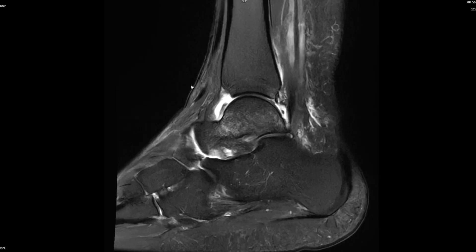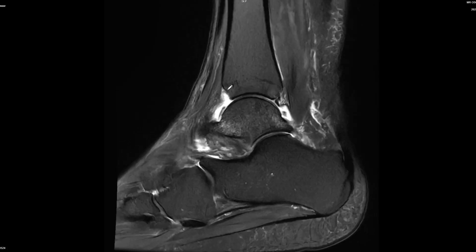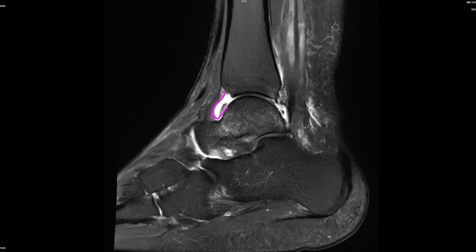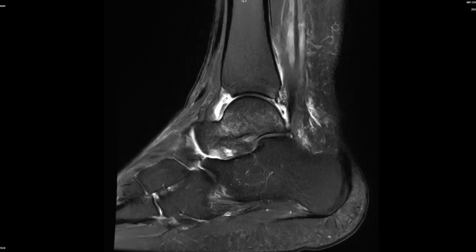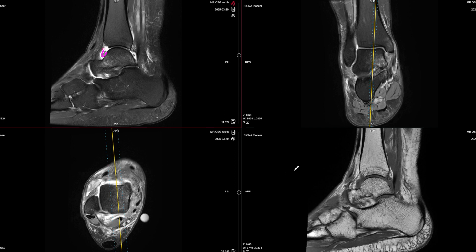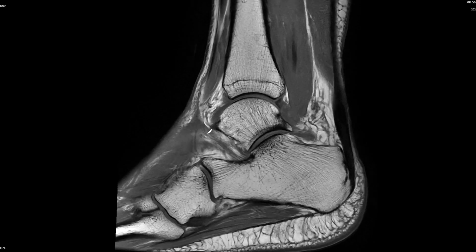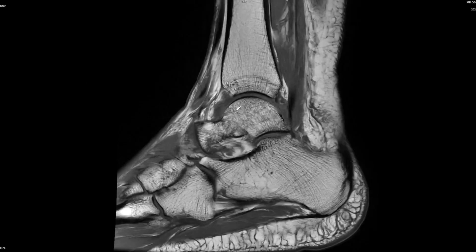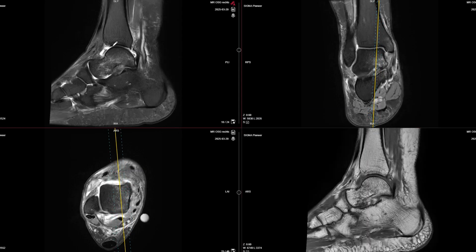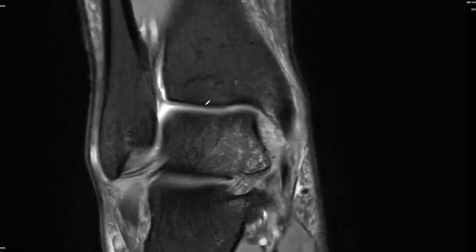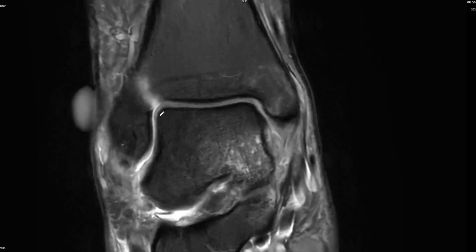When looking at the case I always start with the joint itself. We can see there's a little bit of an effusion here, a couple of days after the trauma, which can be expected. There is a structure in the anterior recess which is not fat - most likely a small blood clot - but it's not an osteochondral body because we don't see any osteochondral lesion at the talar shoulders.